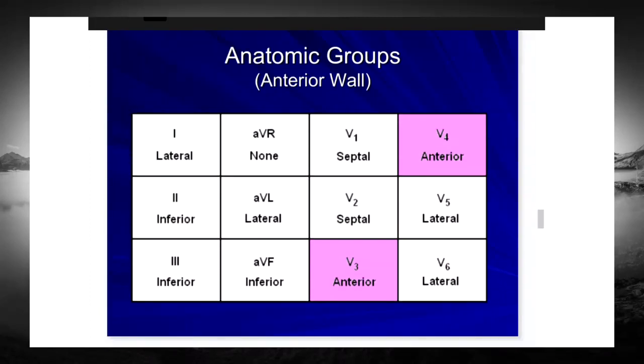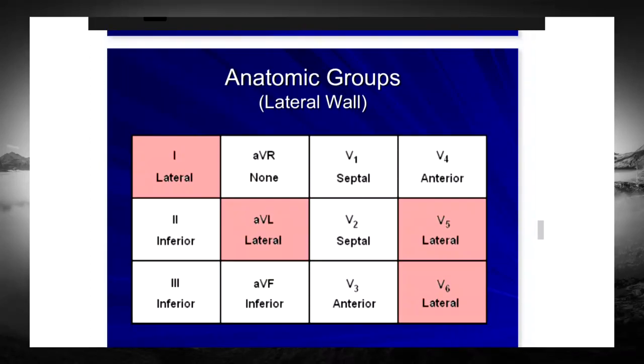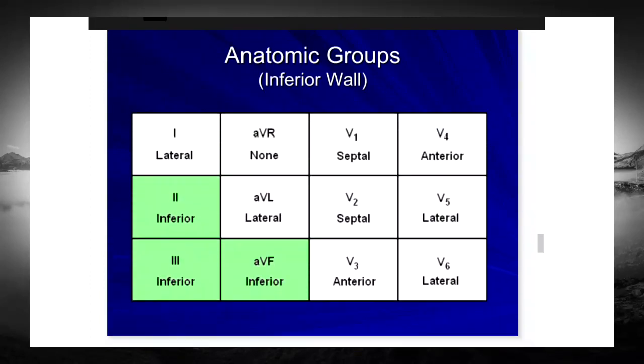Same thing, just talking about what is important. Our anterior walls, this is where we'll see these things. Okay? Our lateral walls are here, and then our inferior walls are there.